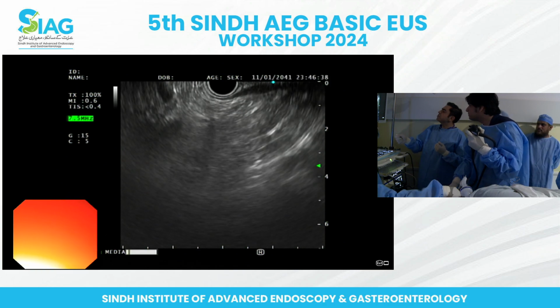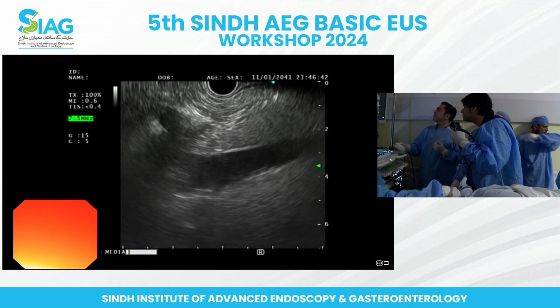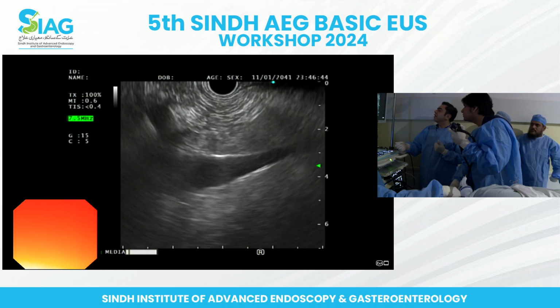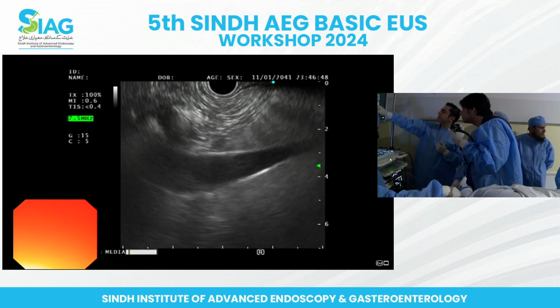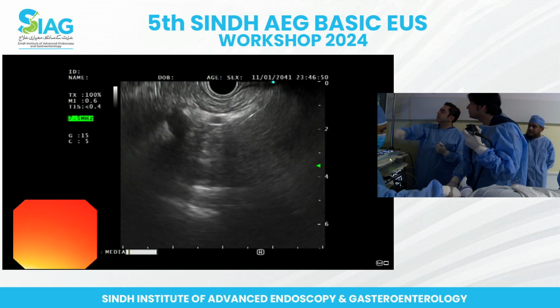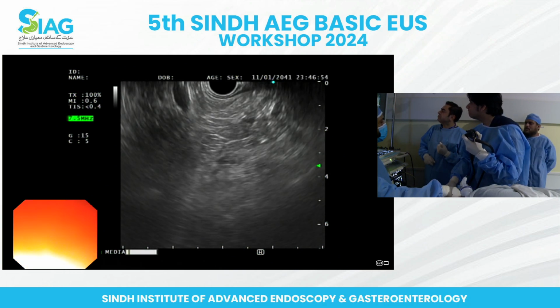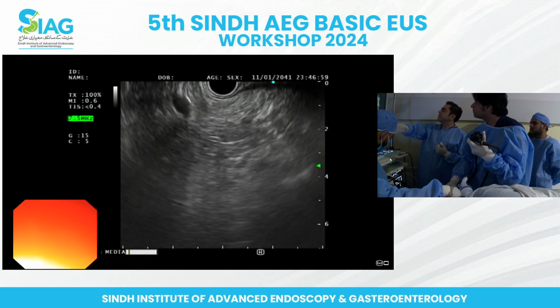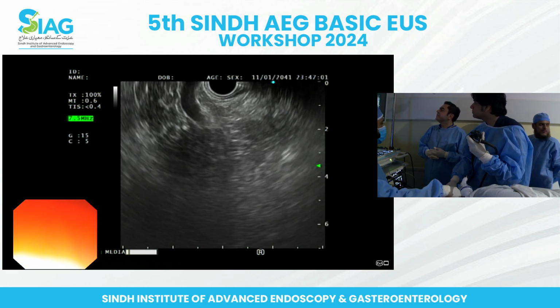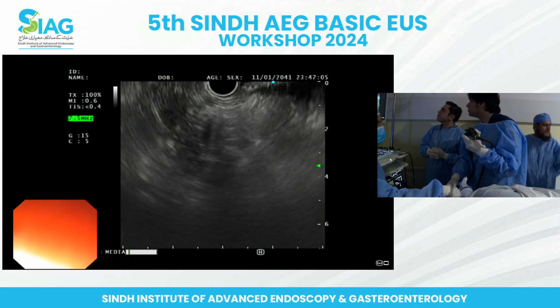So do a clockwise torque now at that position. Yeah, I think probably just move up on this structure. Yeah, so push it down. You can bring that structure inside. I think, guys, we are struggling because of the hiatus hernia, because the tip seems to get stuck there.